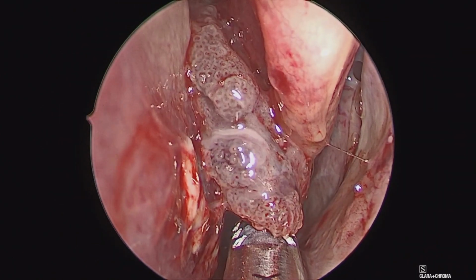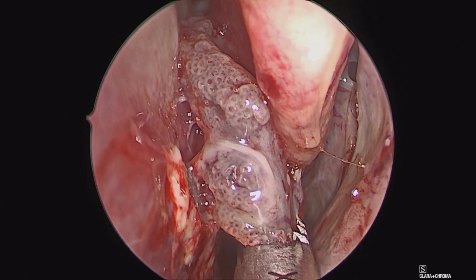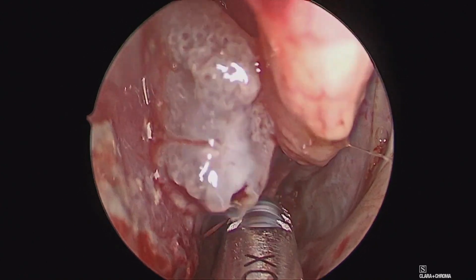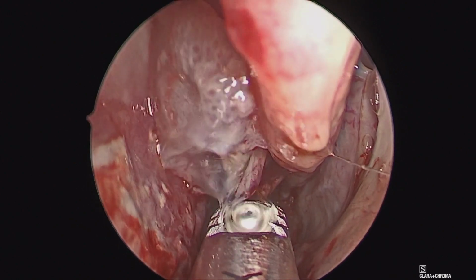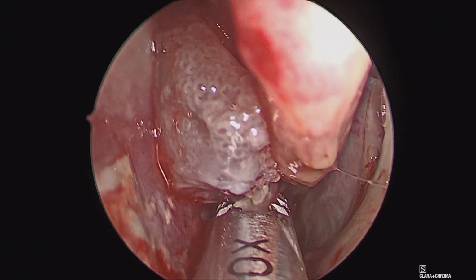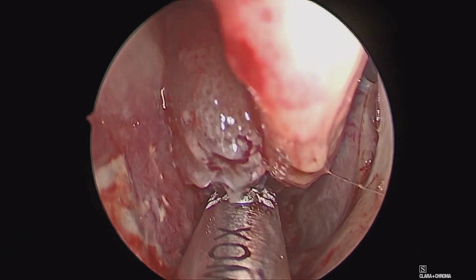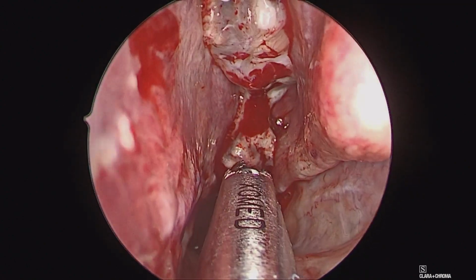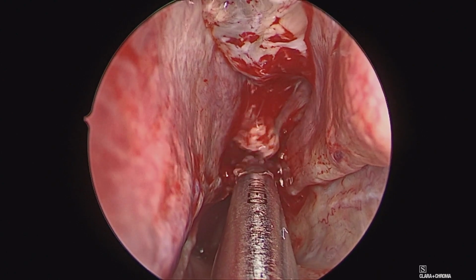After that initial low-hanging tumor is removed from the nasal cavity, we'll then use a microdebrider such as this to debulk the tumor in the area where it has no attachments along the mucosa. As you can see here, we're dissecting up the tumor from the low part of the nasal cavity, again medial to the middle turbinate towards the olfactory cleft, carefully assessing for any mucosal attachments as we go.